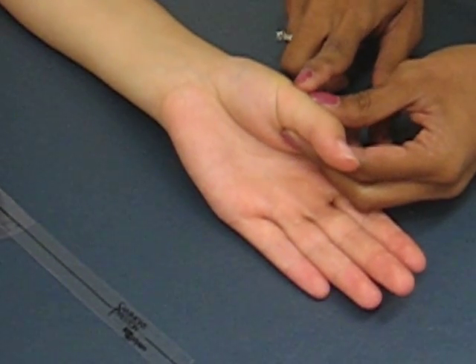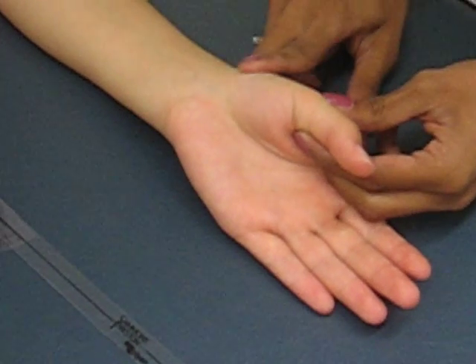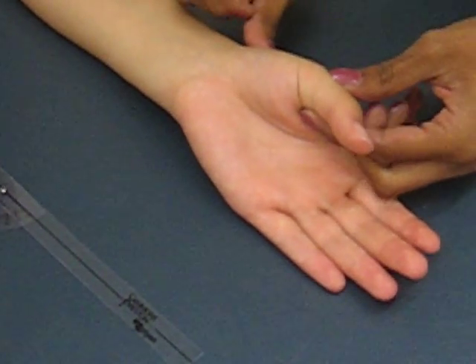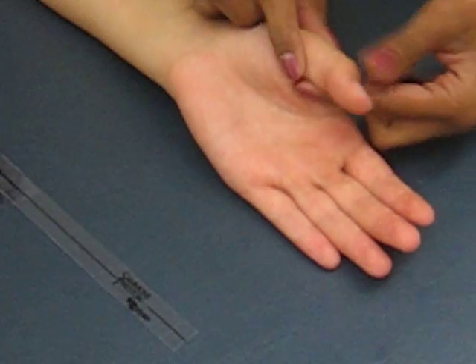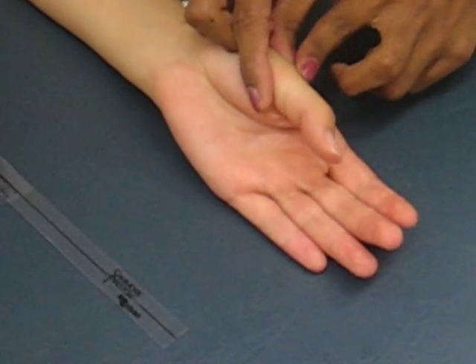The stationary arm will be along the first metacarpal bone, which will be right over here. And the moving arm is going to be along the proximal phalanx, which is right here.